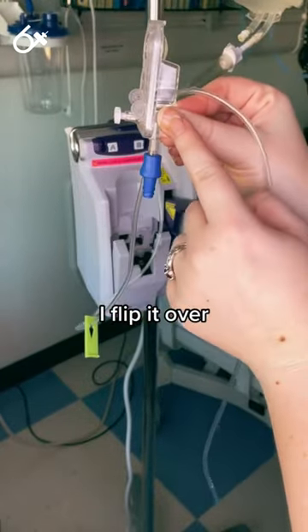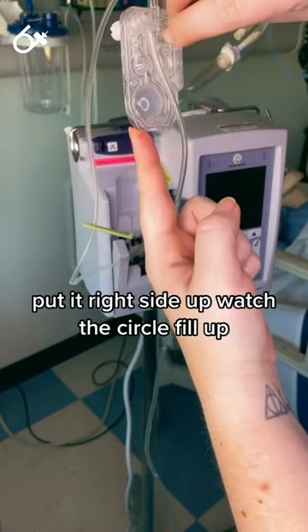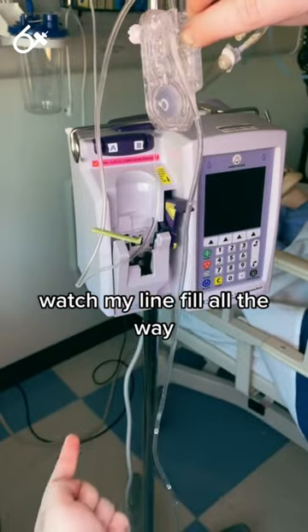First I flip it over, I watch that rectangle fill up, put it right side up, watch the circle fill up, watch my line fill all the way.